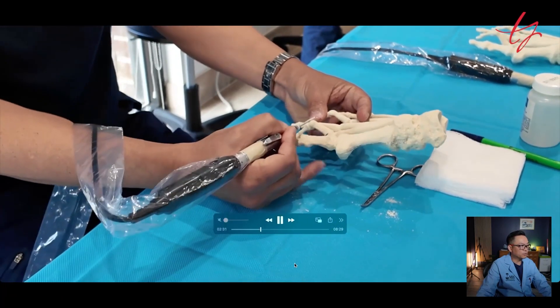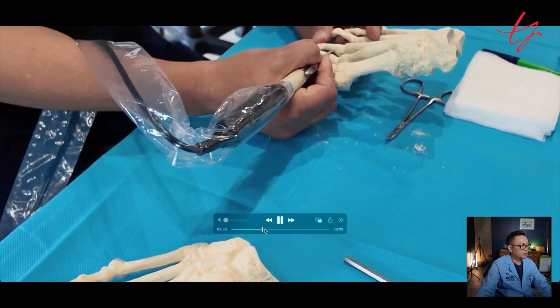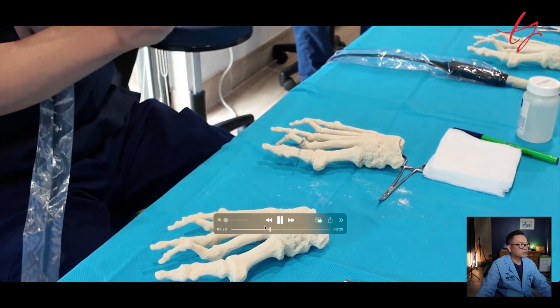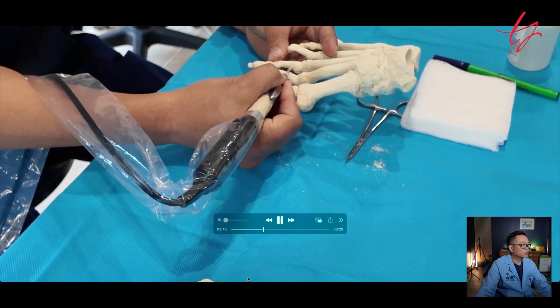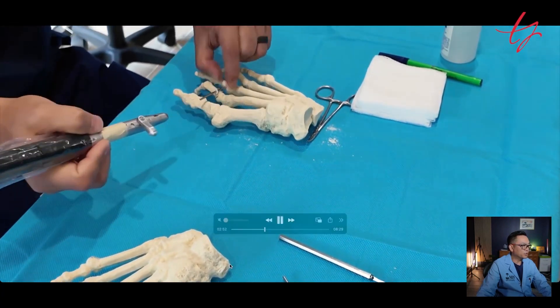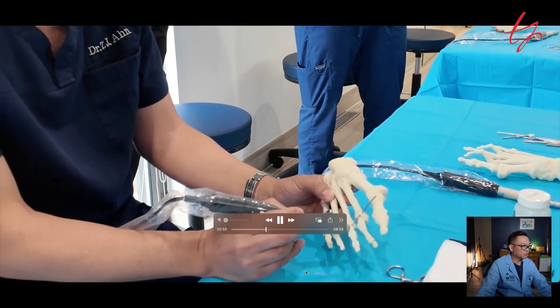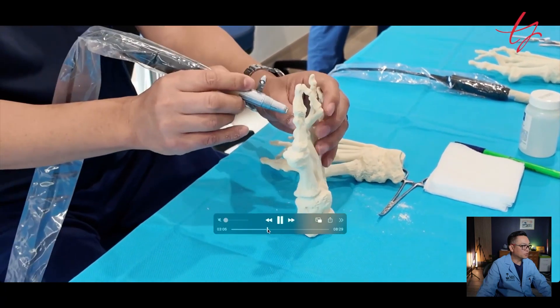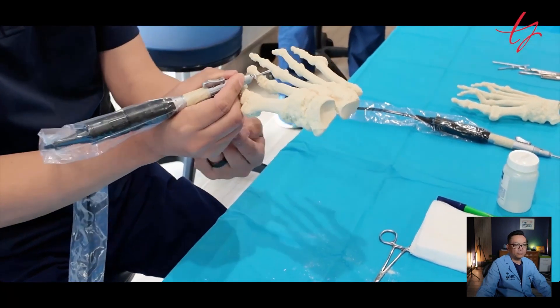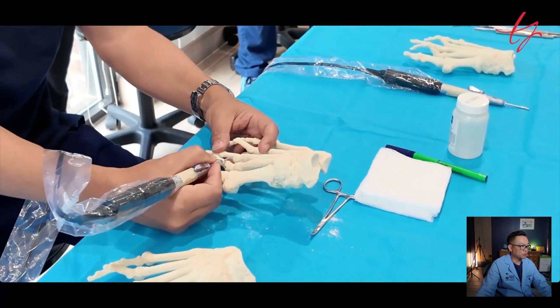I'll also show you the dorsal approach — so you can do plantar or dorsal. With the dorsal approach, make a pilot hole and create a plantar flexor wedge from the pilot hole. You can also check it with X-ray under fluoroscopy — disengage and look at it, then reattach and finish the osteotomy. The dorsal approach is slightly more fail-safe, but it all depends on the surgeon's preference. I prefer the plantar approach, but certain cases the dorsal approach works great.